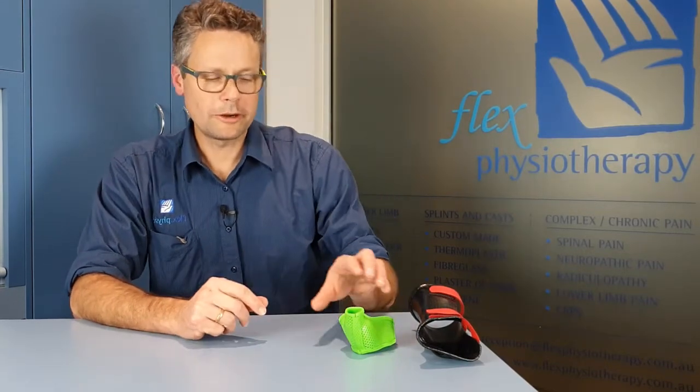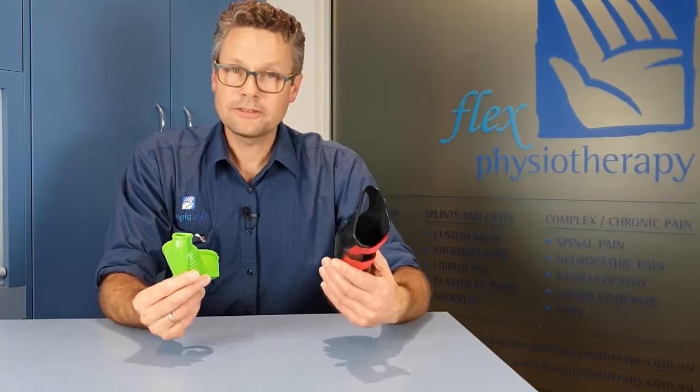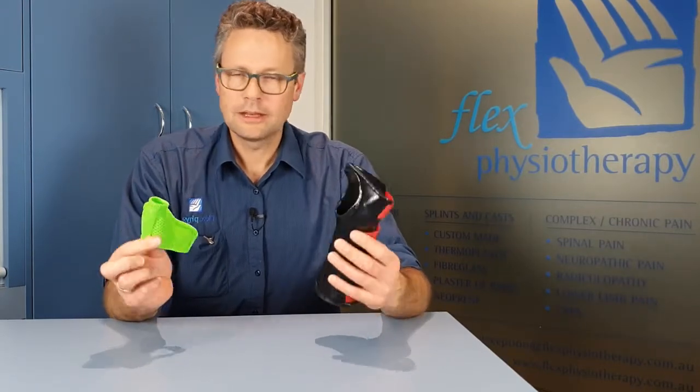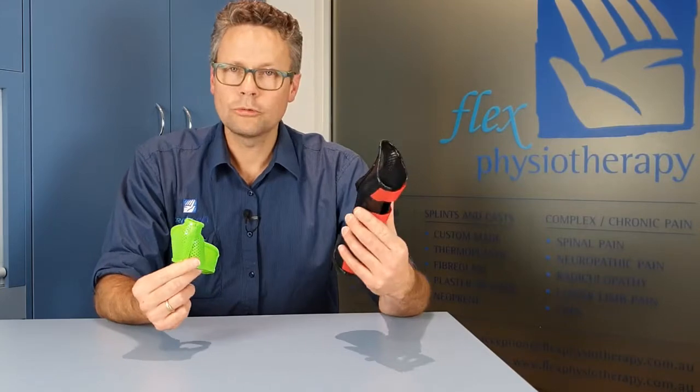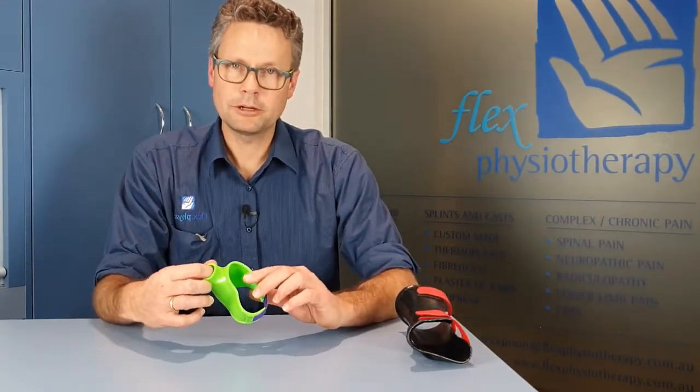Hi, welcome to Flex Physio. My name's Ian. Here at Flex Physiotherapy we make lots of thermoplastic splints. You've probably seen people wearing them — they come in all sorts of shapes and sizes and colours. They start as a flat sheet of thermoplastic and then they get moulded to fit thumbs or wrists or fingers, or whatever is necessary, and used for all sorts of different injury and pain problems.